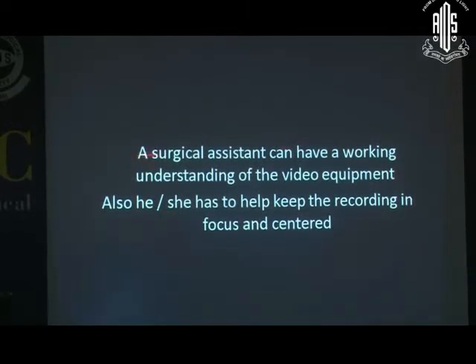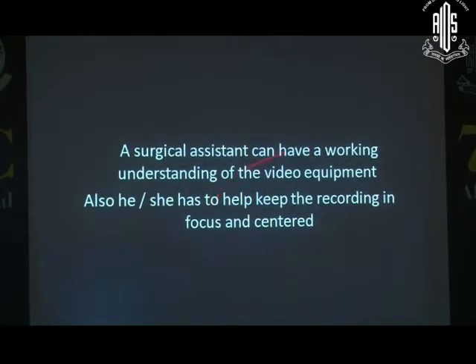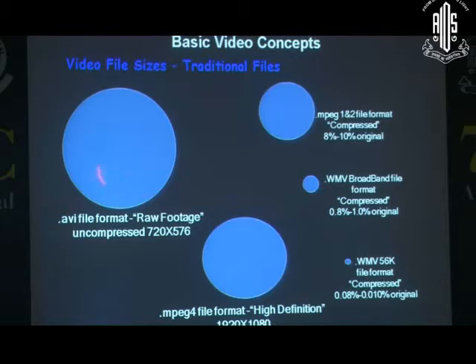Now, it's important that your surgical assistant or the floor assistant has some understanding of the video equipment, as he or she is the one who is going to help you out with the nitty-gritties of recording. Basic video concepts have already been dealt with by Dr. Gaurav Shah. Now it's important to realize that the AVI file format is the largest, and MPEG-4, which he was talking about, is a high definition format. It's a moderately sized file. So this is where we should try to put our money, because this is something that's working across platforms.